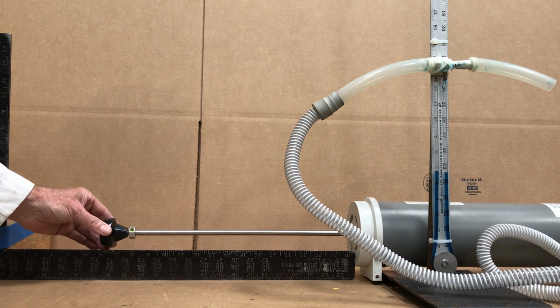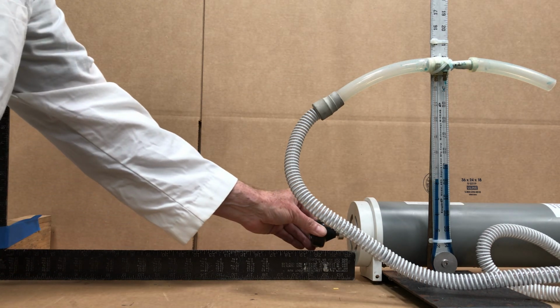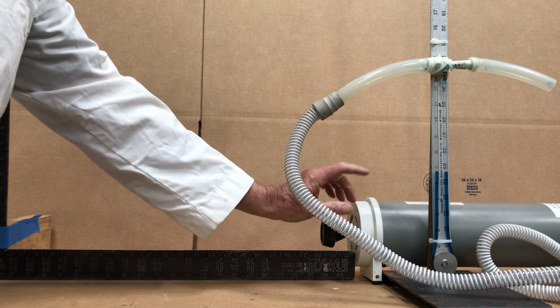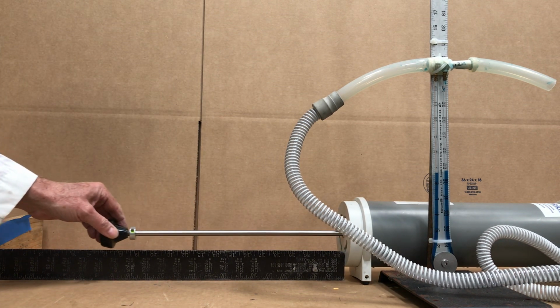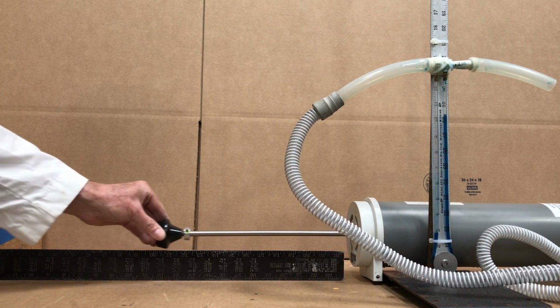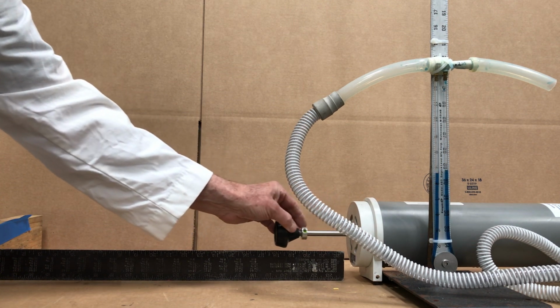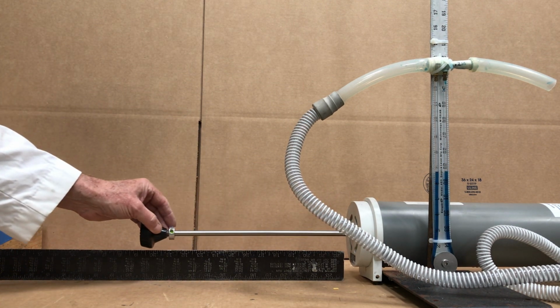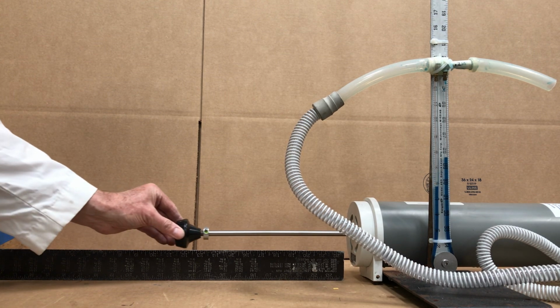So we can simulate a breath by pushing on this thing. You see you get a steady flow if you have a steady difference in the manometer. And then of course we can do it again, a little bit faster this time. And you see the manometer has a little bit of dynamics to it. It has a little bit of momentum and so on. So the columns of fluid tend to bounce a little.